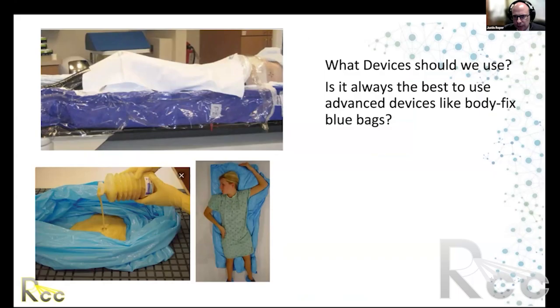We tend to reserve these types of immobilization devices where an extra degree of immobilization is needed, for example, with a stereotactic procedure or another procedure in which the dose is quite conformal and the margins are quite small. For palliative cases, we wouldn't use these devices. We wouldn't put forth the extra time and energy and require the patient to spend that additional time in our department. Next slide, please.